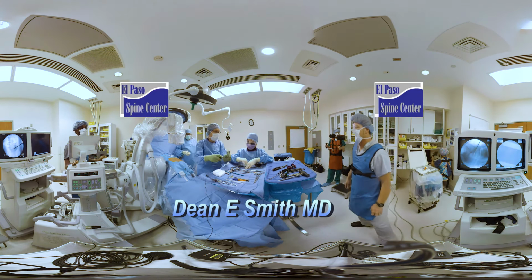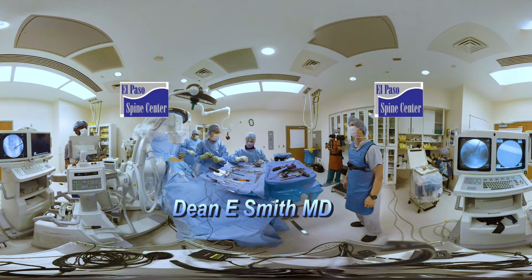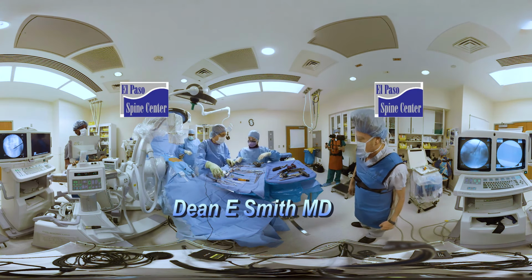Can you find another pin, or is that the only pin? Okay, then we're going to have to do it another way. Do you have a needle driver?